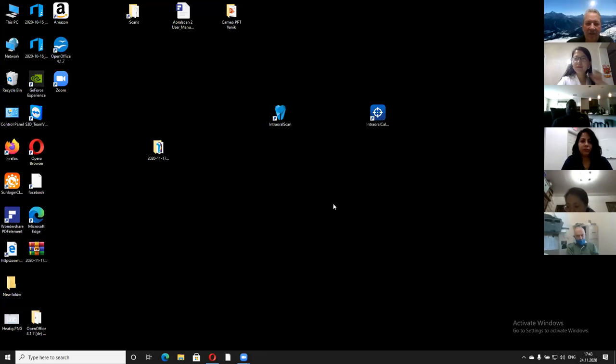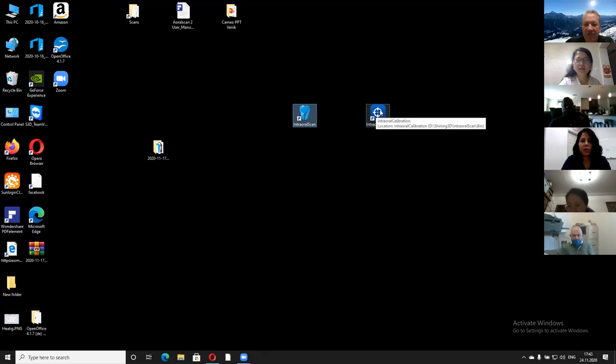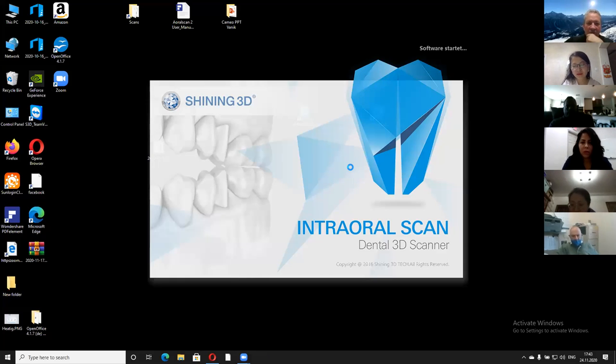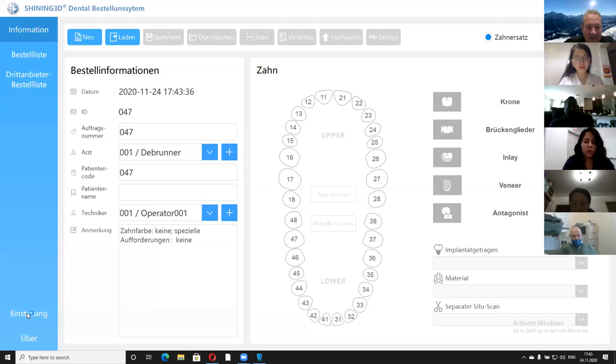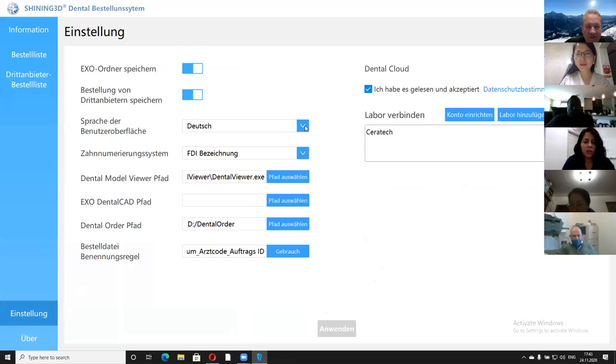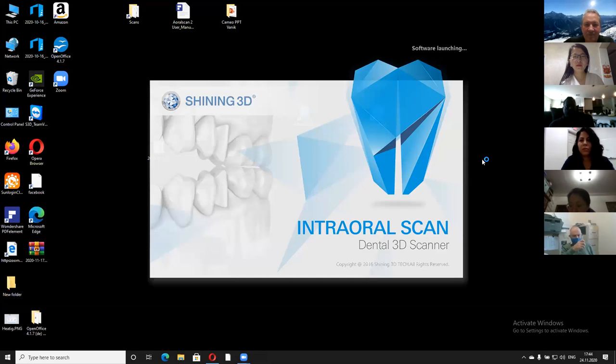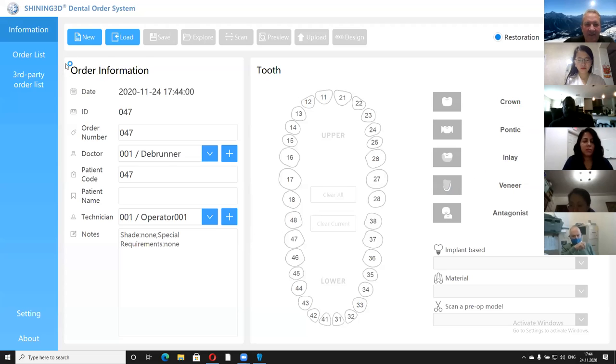Yeah. So this is the software for the scanner. It's called Intraoral Scan. And this would be if you want to calibrate it. So calibration has already been done. You just hit that button and it starts. So let me start the Intraoral Scanning software to give you an idea what you see here. I hope it's in English now, otherwise I'll have to quickly change it because I was scanning at the hospital. Oh yeah, now it's in German. So I go here and change it to English. Now it should be in English, hopefully. And I start it again. Yes, now it's in English.